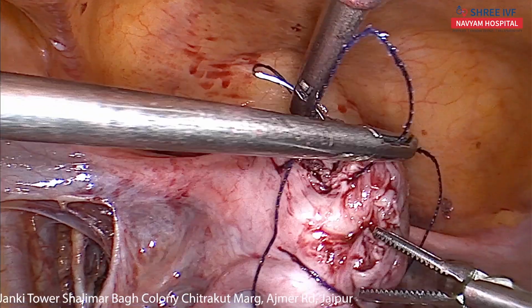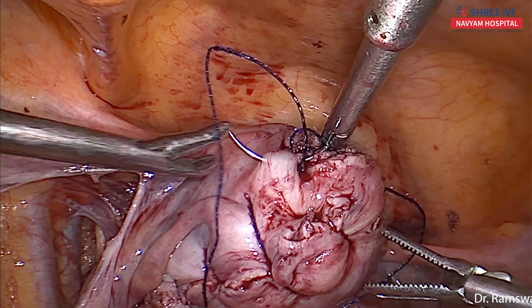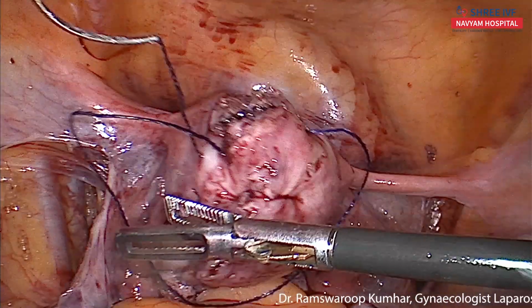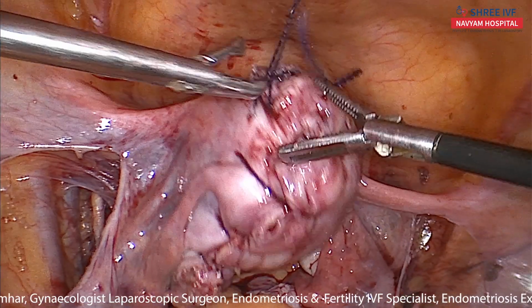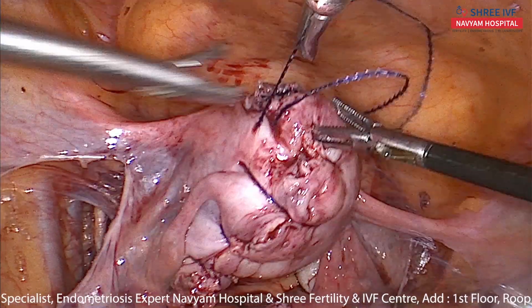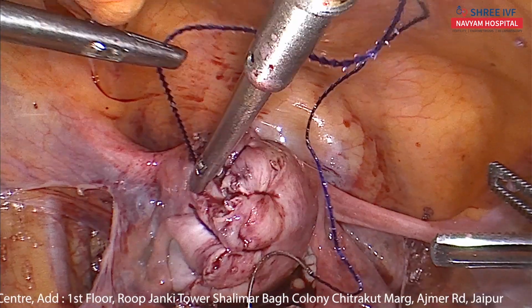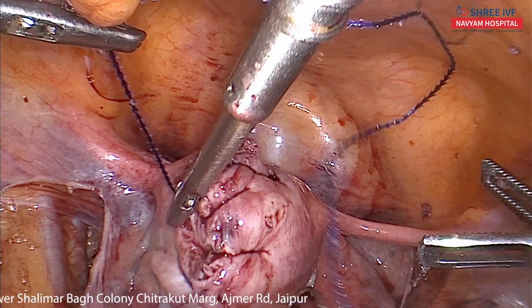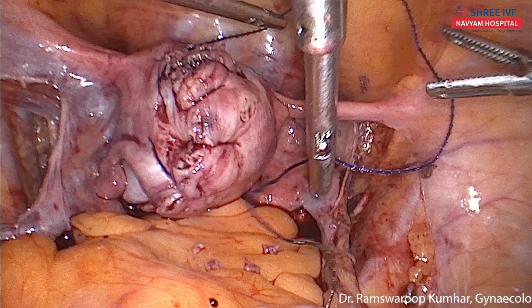This suture line is slightly loosened and some serosa is exposed, so we are taking 1 or 2 extra bites. We can take 1 more bite here and then scissor.